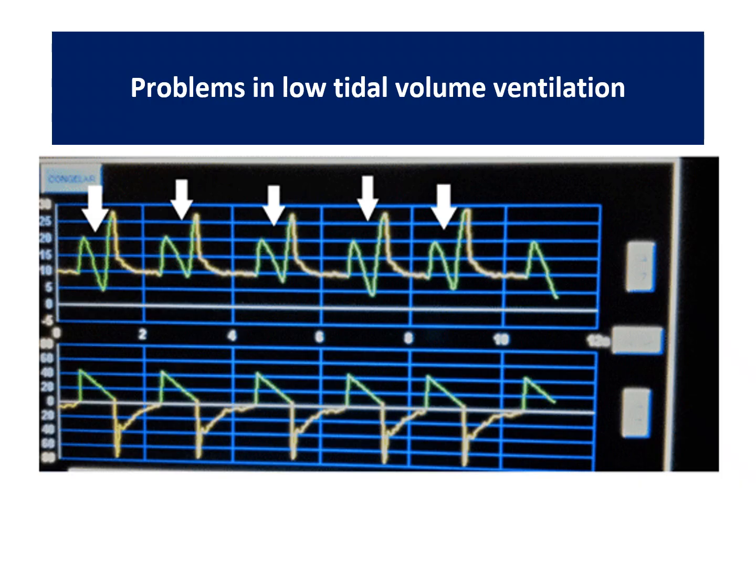So again, you don't treat all the ventilator graphs which you are seeing. You see that there is some flow asynchrony. If it is significant, you have to obviously do the needful. But if it is not significant, not really causing any problem, you can just wait and watch. But you should know that there is some amount of flow asynchrony.